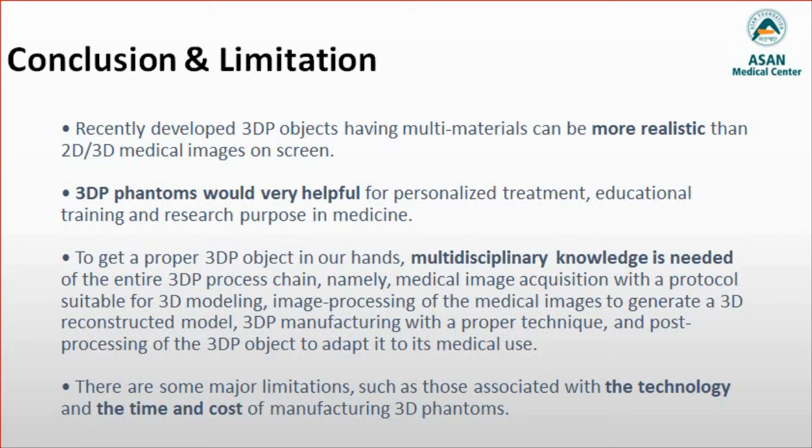Furthermore, to get a proper 3DP object in our hands, multidisciplinary knowledge is needed of the entire 3DP process chain, namely, image acquisition with a protocol suitable for 3D modeling, post-processing of the medical images to generate a 3D reconstructed model, 3D manufacturing with a proper 3D technique, and post-processing of the 3D object to adapt it to its medical use.